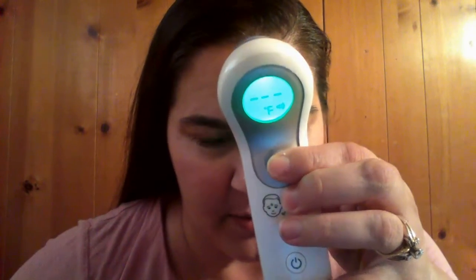It's got this nice little cap to keep the sensor clean. You hit the power button here and take your temperature.